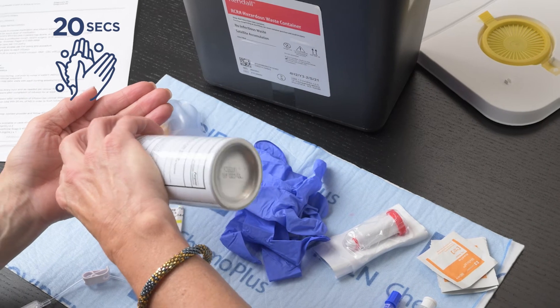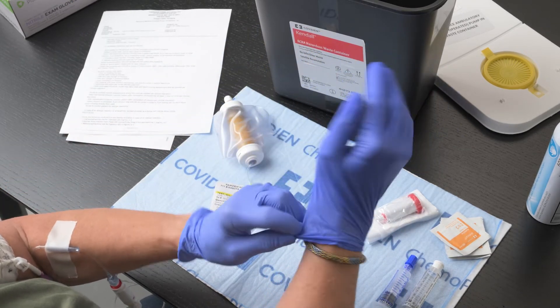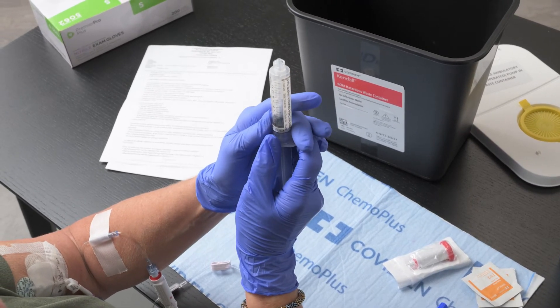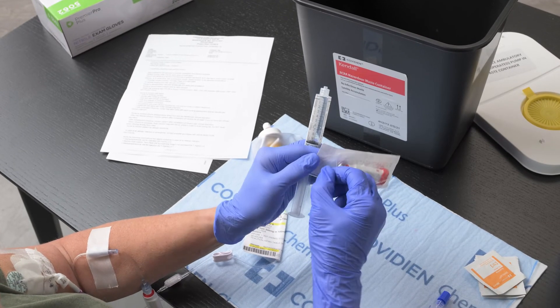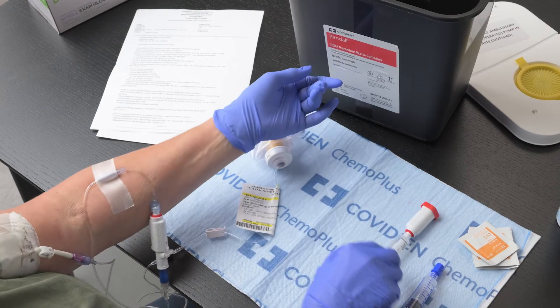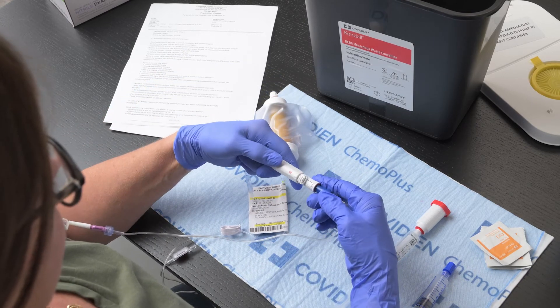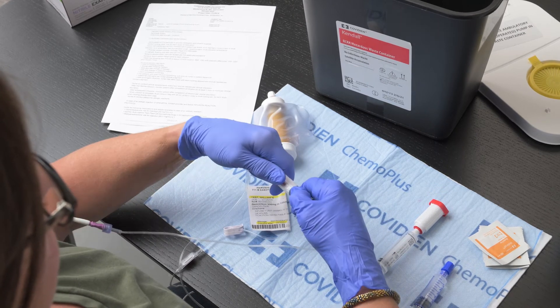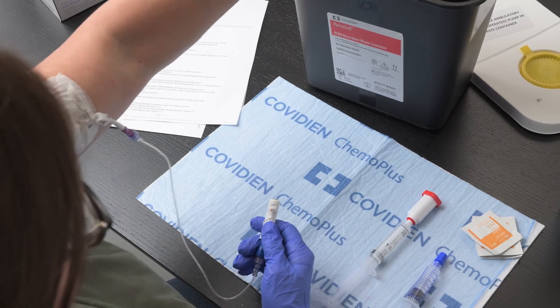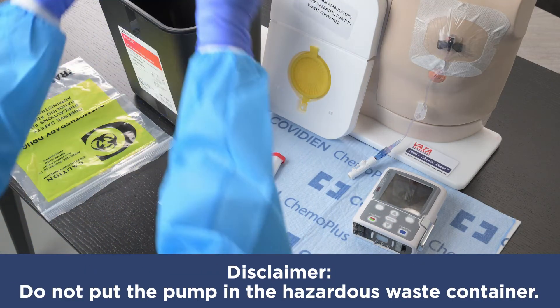Clean your hands and apply gloves. Remove any air from the saline syringe, taking care not to contaminate the tip. Open the female connector and attach to the saline syringe. You can set this down on the clean dry surface. Remove tape from the flow restrictor now. To disconnect the medication line, grasp the connector with the three red lines up. Press down on the round white button on the male connector and pull the female and male connectors apart. This takes a little strength. When you have the medication disconnected, discard in the hazardous waste container. If your medicine is attached to an electronic pump, disconnect the tubing from the pump and place everything except the electronic pump in the container.